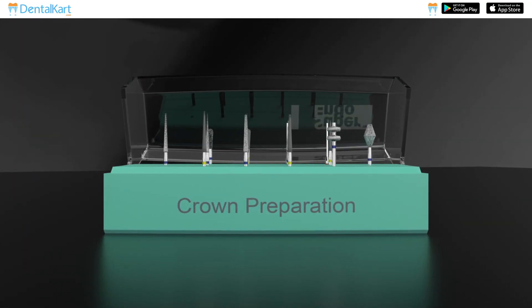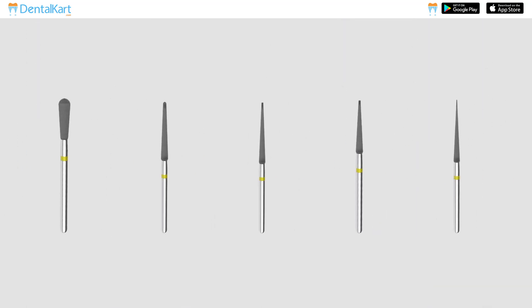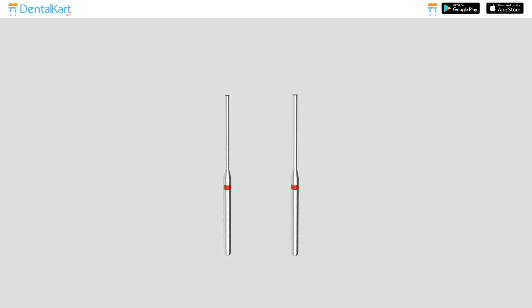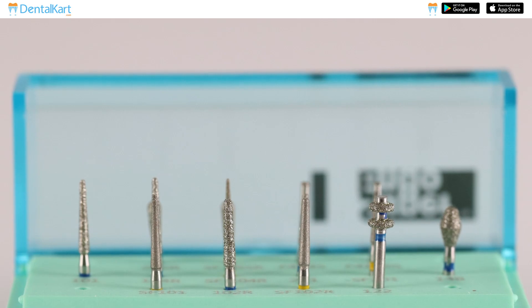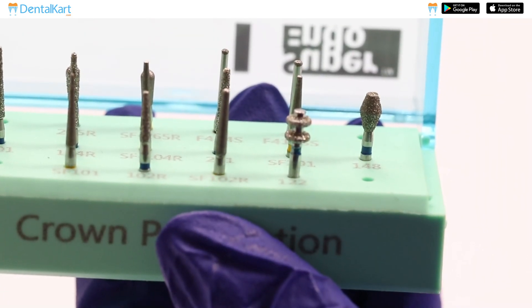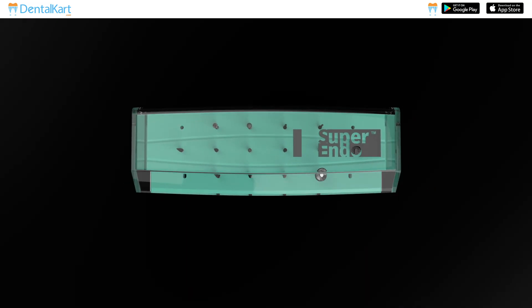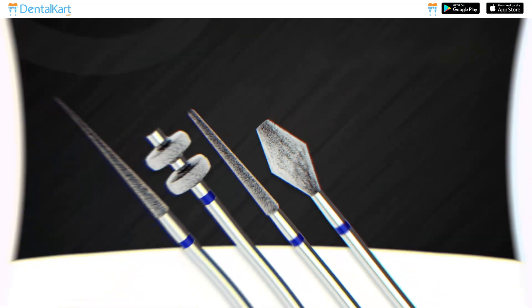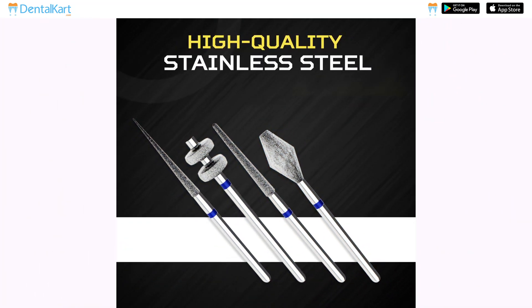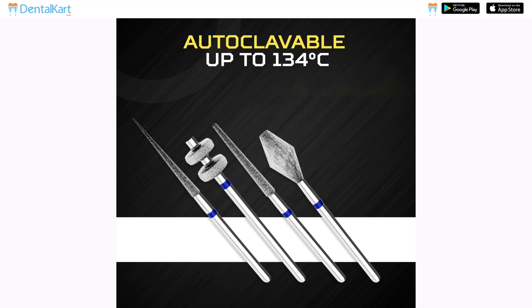Yellow color coated burrs are extra fine burrs with a particle size of 20 to 30 micrometers. The Super Endo Crown Preparation Burr Kit contains 7 blue color coated burrs, 5 yellow burrs, and 2 red color coated burrs. These are high quality diamond burrs. The base is made of silicon to hold burrs tightly. Burrs are organized in a well-labeled plastic burr block. The shank of burrs has a friction grip. Burrs are made of high quality stainless steel and the kit is autoclavable up to 134 degrees Celsius.